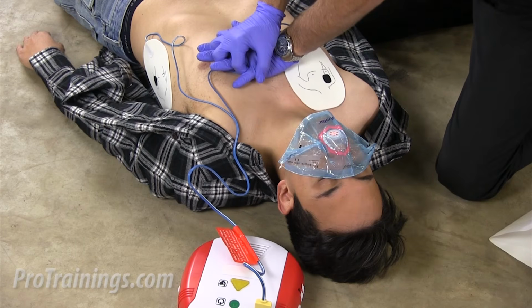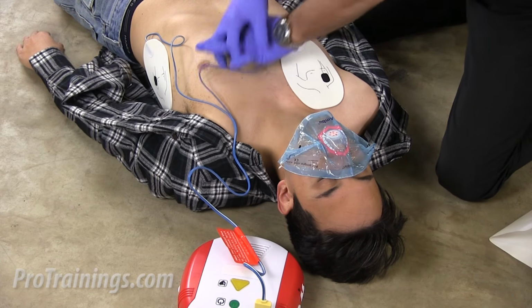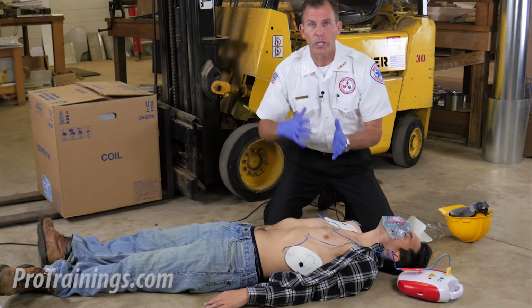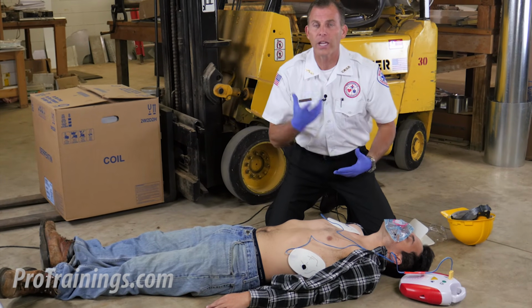Whether it advises to shock or not, we're going to go right back into our CPR as prompted, and we're going to continue this until EMS arrives, until further help arrives that's equally trained or higher, or my patient begins to move and respond and breathe normally.